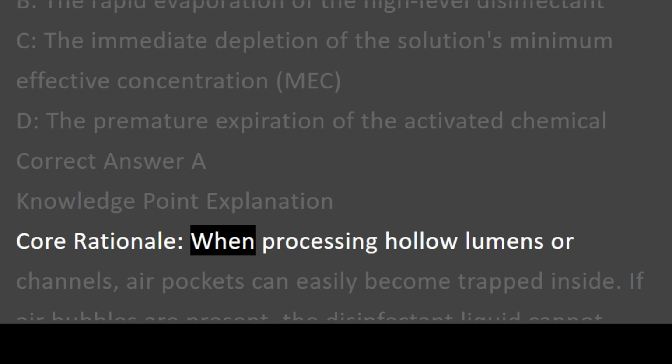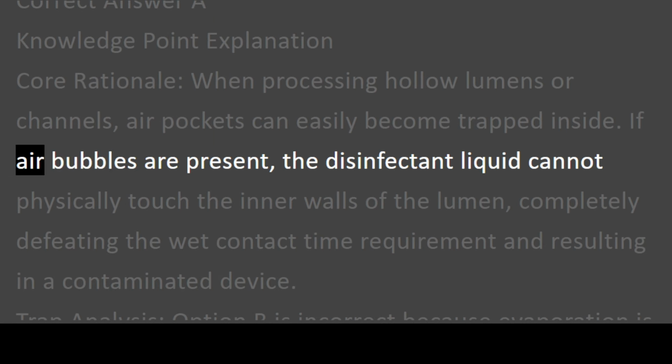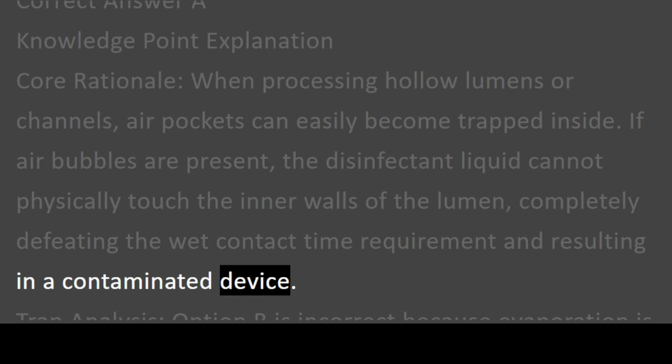Core rationale. When processing hollow lumens or channels, air pockets can easily become trapped inside. If air bubbles are present, the disinfectant liquid cannot physically touch the inner walls of the lumen, completely defeating the wet contact time requirement and resulting in a contaminated device.